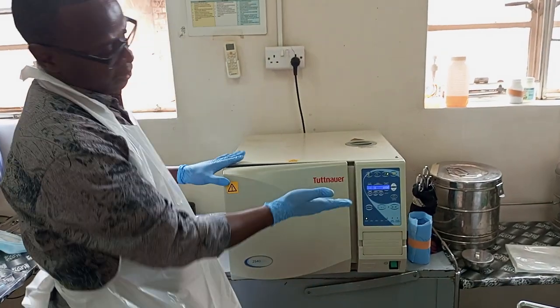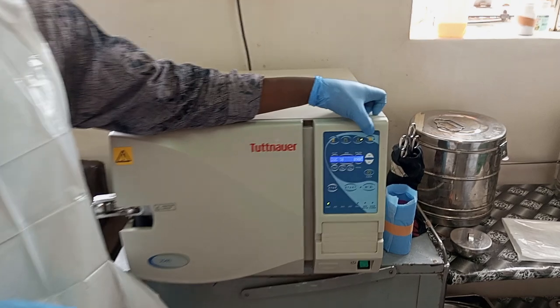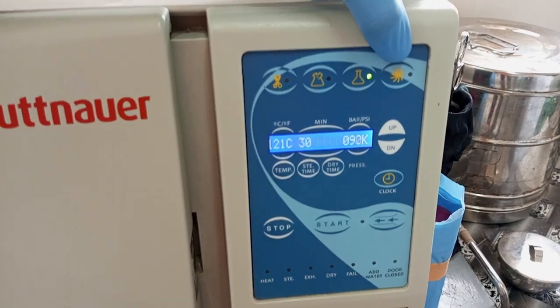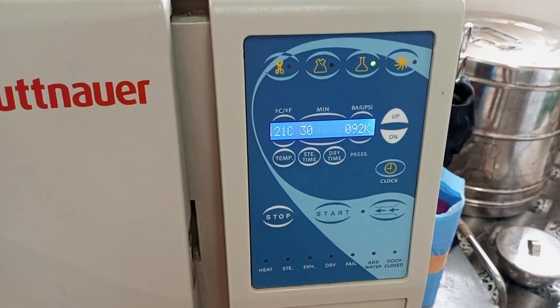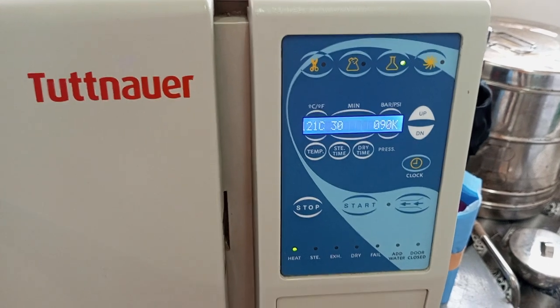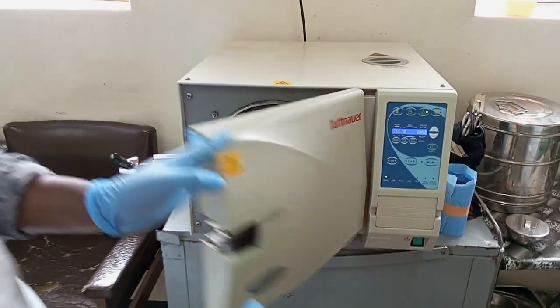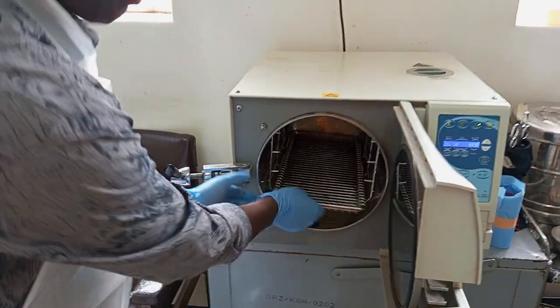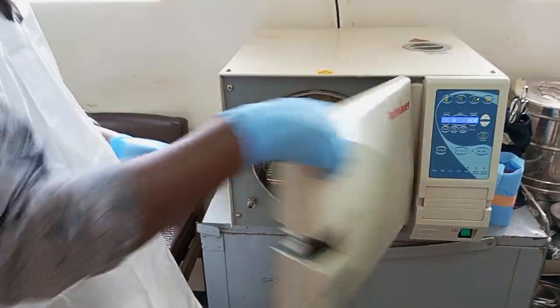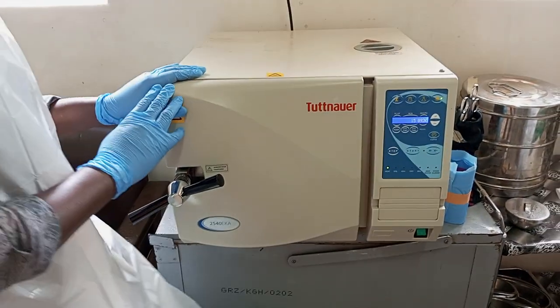Last stage, if you check once again on our display there, there's this funny-like structure, a propeller-like structure. This indicates you are cleaning instruments which are wet, and all you are interested in is to have them dried up by airing. Okay? You bring the instruments here, they are wet, you put them on a tray, put them back, close tightly, place the drying pattern.